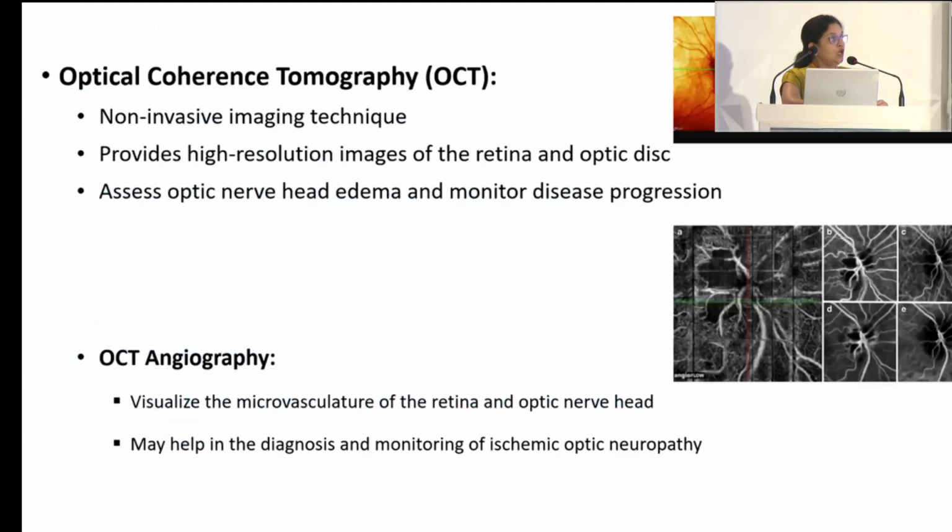Optical coherence tomography is a non-invasive imaging that provides high resolution imaging of the retina and the optic disc to assess optic nerve head edema and monitor disease progression. OCT angiography also visualizes the microvasculature of the retina and the optic nerve head, and it helps to diagnose and monitor ischemic optic neuropathy.